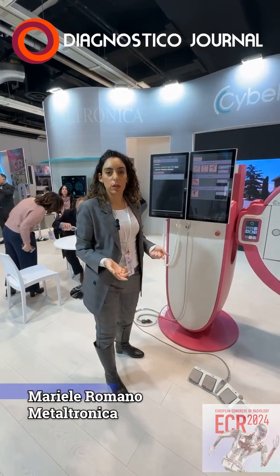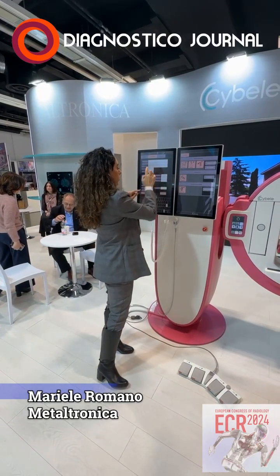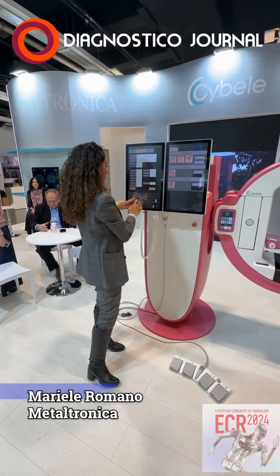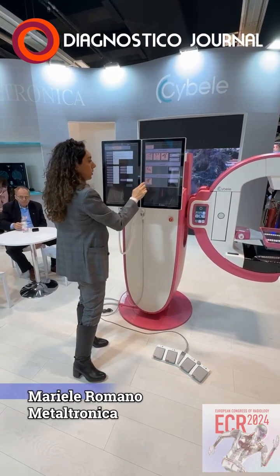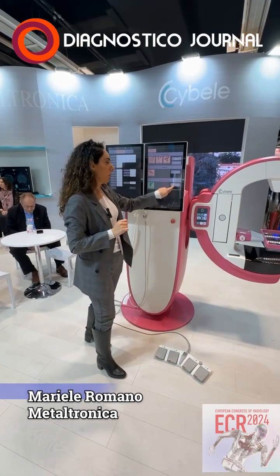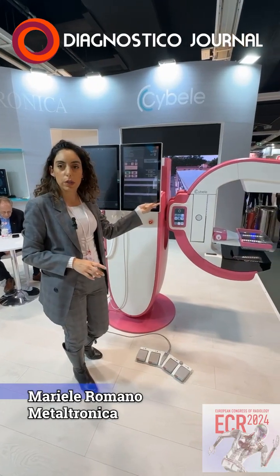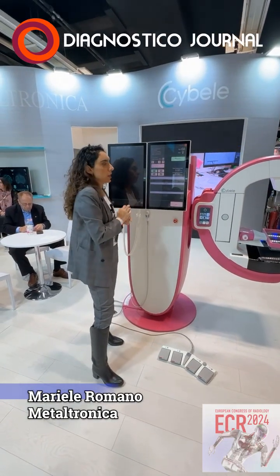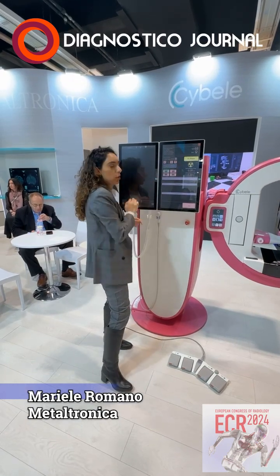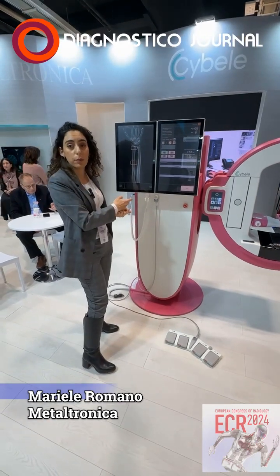And as last, the third screening option that we have is the bone densitometry. So you click on bone health, and it's almost straightforward how it works. You just release the compression, you place your arm on the Potter-Bucky, and you have already some preset. You just click on expose, you shoot, and then here it will appear the X-ray of the arm.